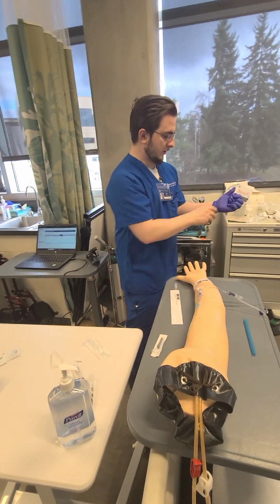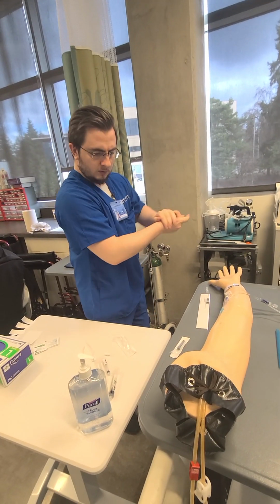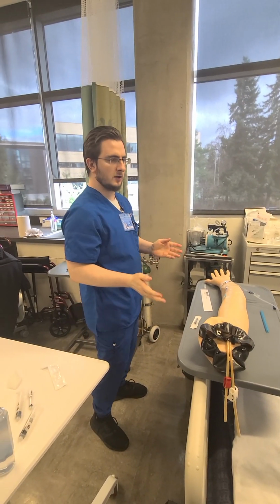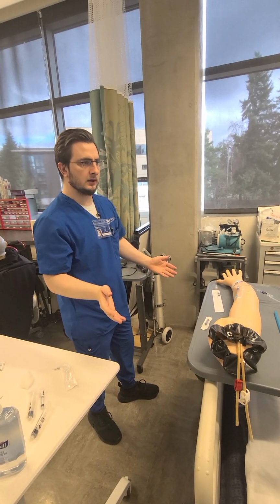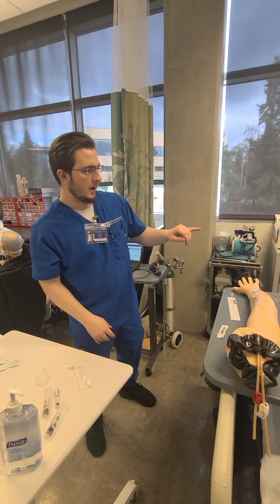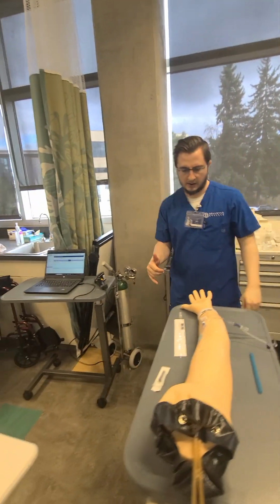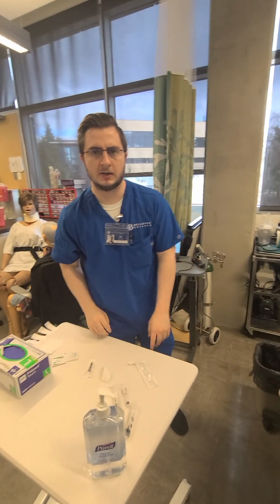Are you all right, Erica? Does it seem to be working? Good. All right. I am gonna check on my patient again one last time before I leave. Ask her if she needs anything else. Make sure that everything's running smoothly, that it's not painful or anything. Lower the bed, lock it, make sure she has her collar, etc. Then I put the tag on. Okay, good. All right, Erica, I'll be back in a minute. I'm just gonna go document everything. Let me know if you need anything, all right? Take all my stuff out and go document.